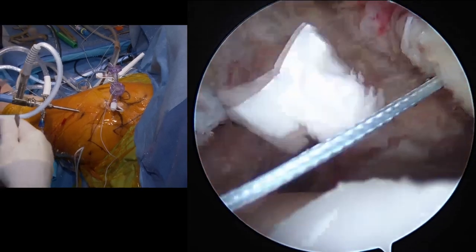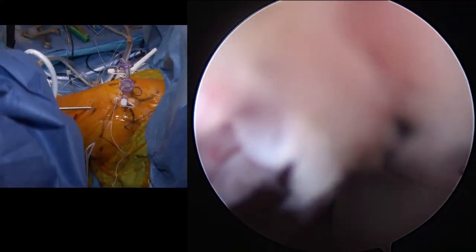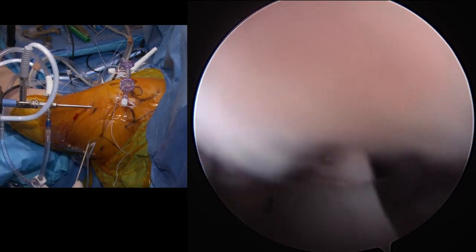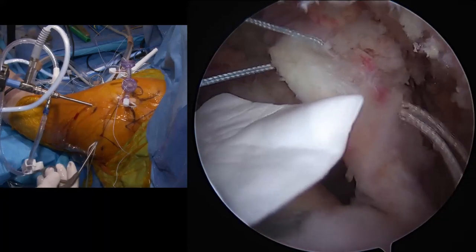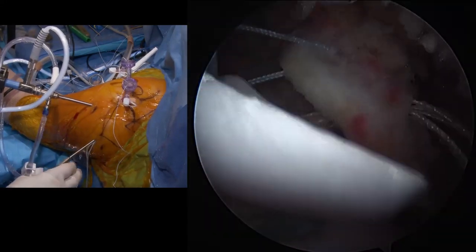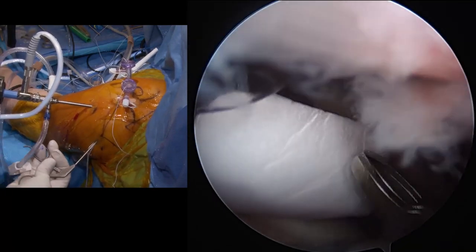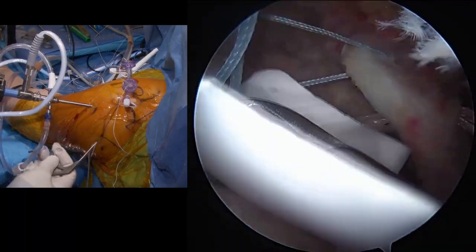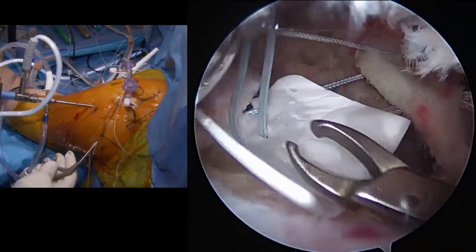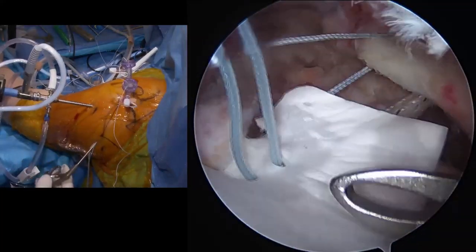Okay, let's have the crab claw. Thank you. And we're just going to, again, make it an interposition graft, so we're just going to lay it down in this area, and we'll go right over the top of it, and we'll trim off whatever is excessive or too big, but this will kind of help hold it in place for us. And we've got these other little sutures here that we can also incorporate a little bit into our repair.